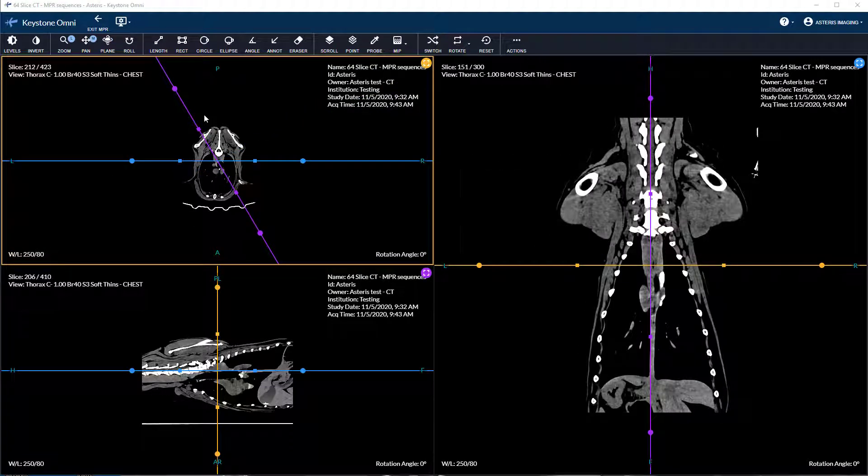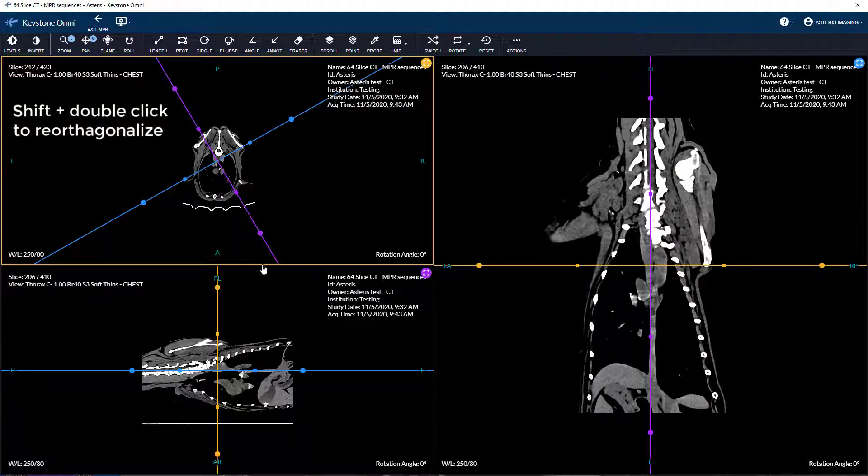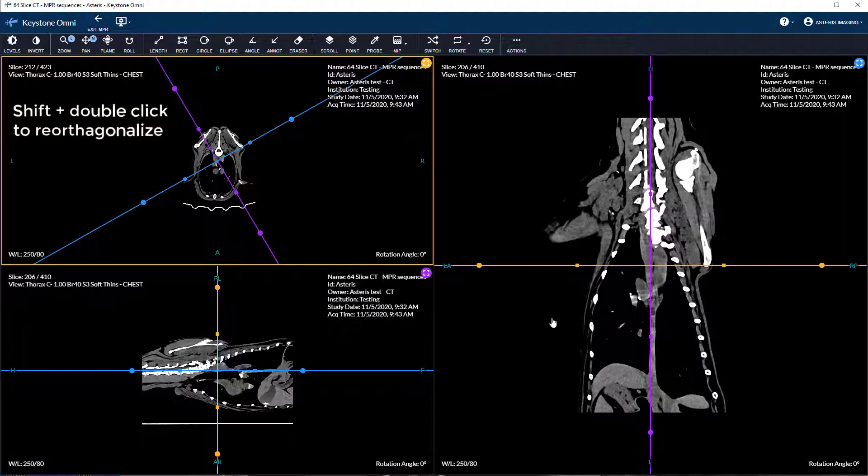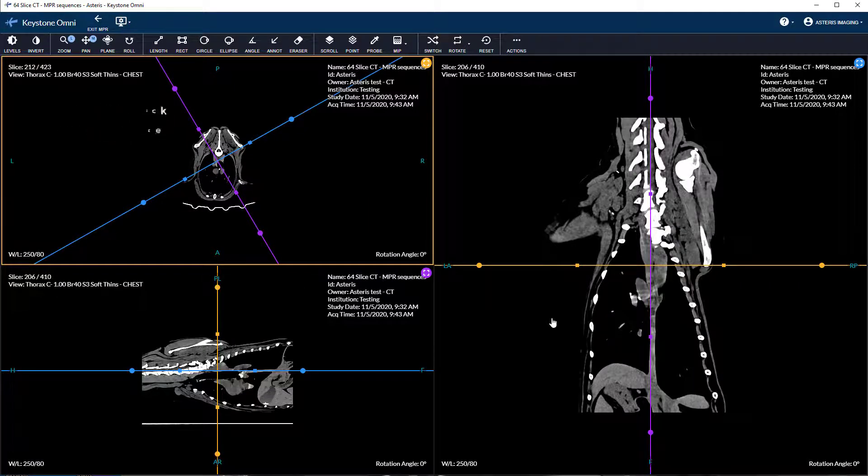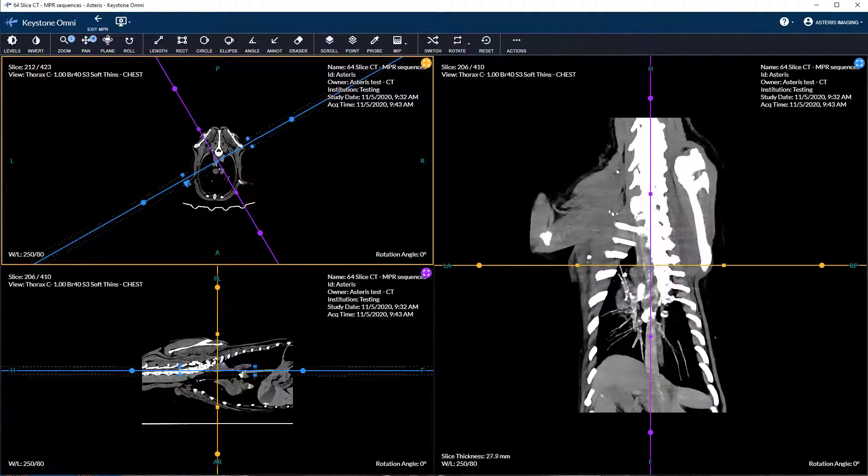Shift plus double click will re-orthogonalize the axis if the axis was rotated individually.